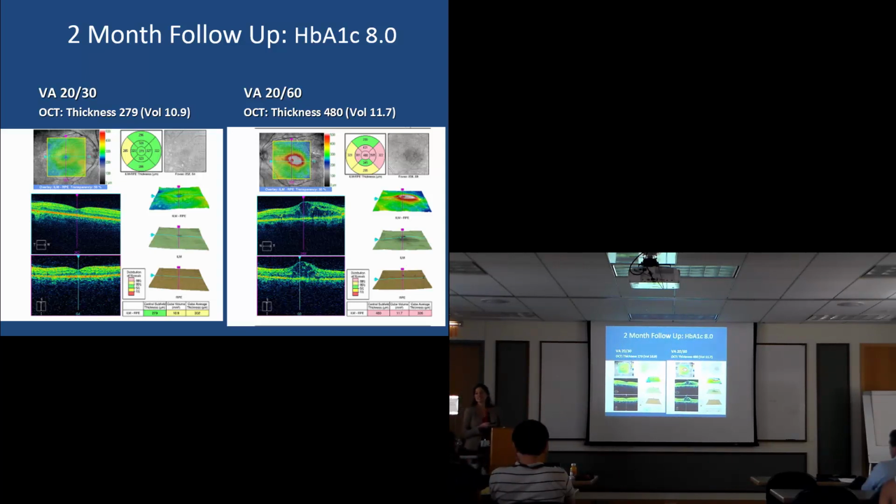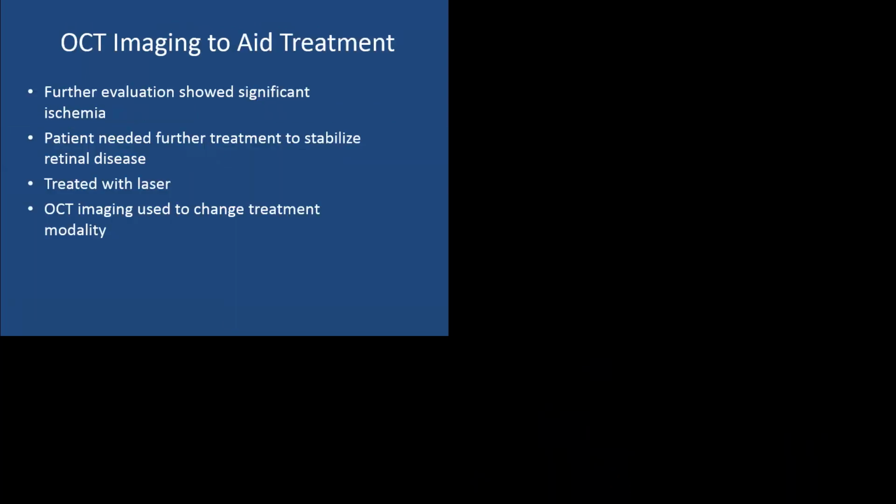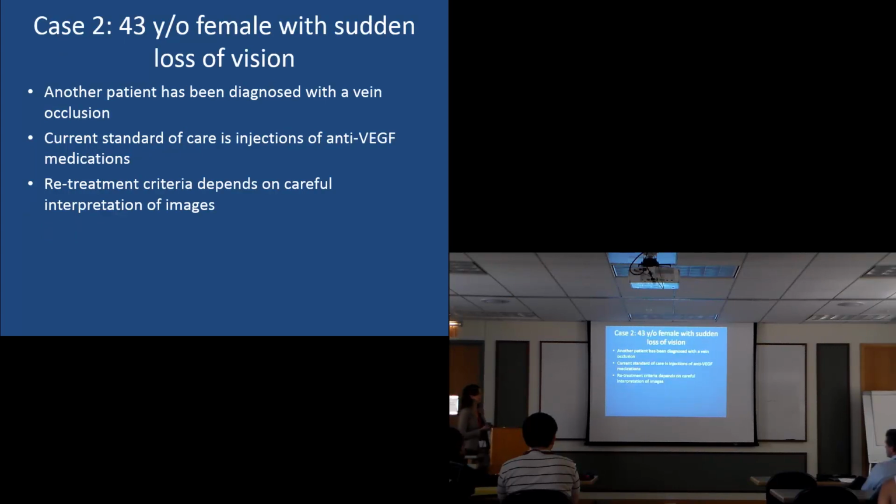And I know there are studies out of your group here with Ryan and his team to look at which layers diabetic disease is really affecting the most, because that can guide our treatment. If it's in the center of the vision, we can do injections, we can treat with laser. All of our markers in clinical trials still use other devices like fundus photography and clinical exam for when to treat, but hopefully in the next couple of years, OCT will really guide our treatment.